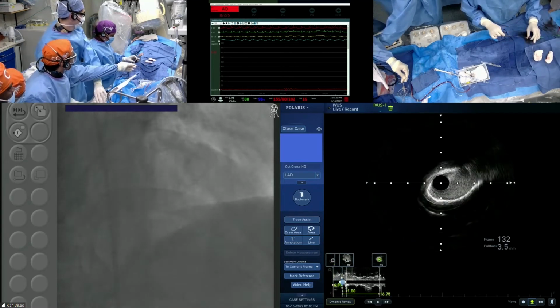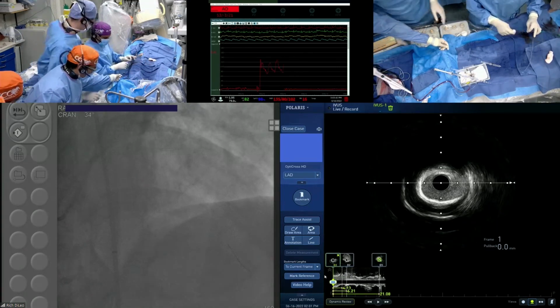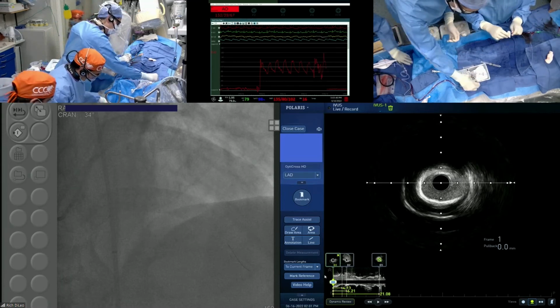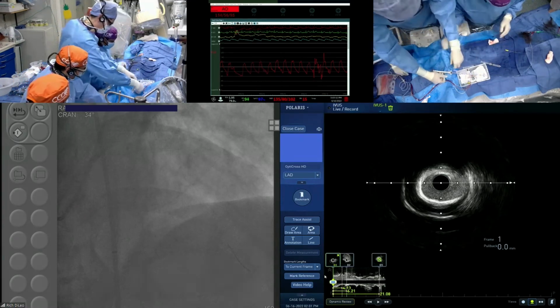I was always in Greg's camp that I wouldn't necessarily want to burr into an aneurysm, and may have tried a non-compliant balloon and then Shockwave. Well, let's see. First of all, the pressure is good, so there's no perforation, Dr. Waxman. We'll take down this factoid. Very good.